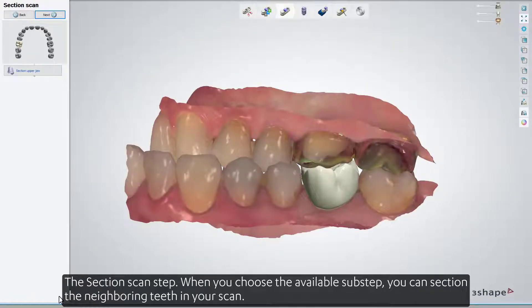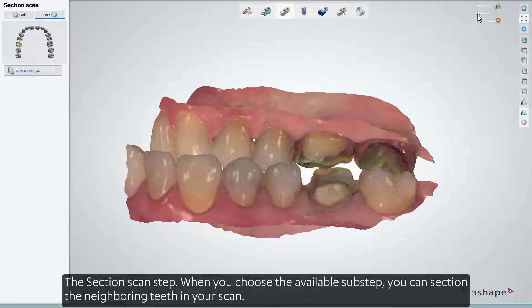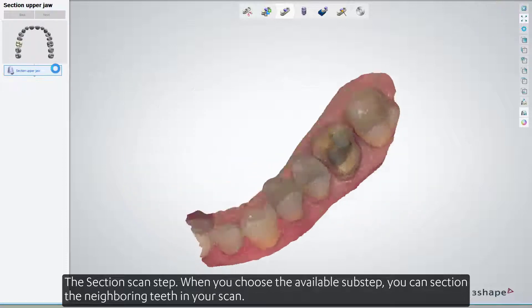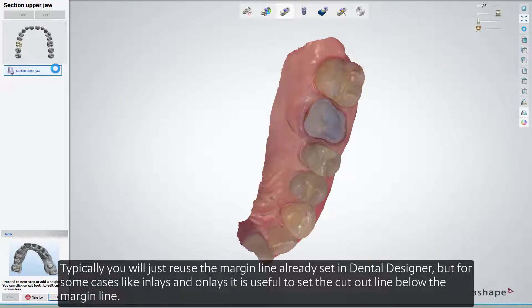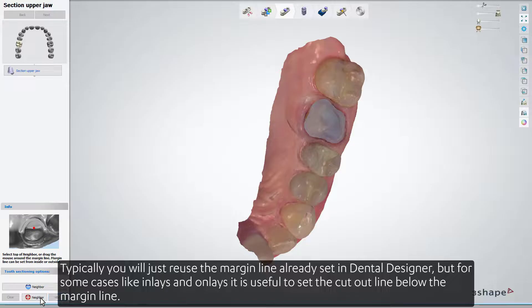The next step is the Section Scan step. When you choose the available sub-step, you can section the neighboring teeth in your scan. Typically, you'll just reuse the margin line already set in Dental Designer. But for some cases, like inlays and onlays, it's useful to set the cutout line below the margin line.